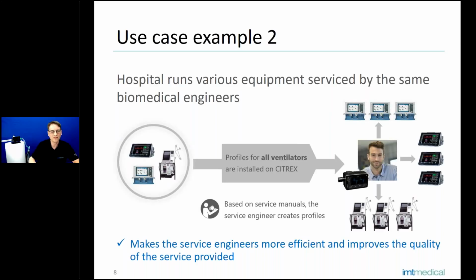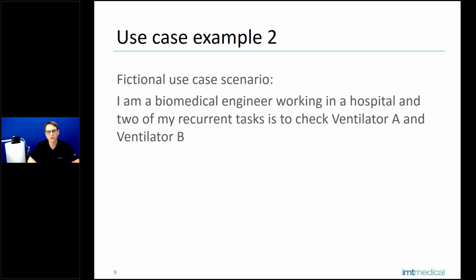So based on this use case example number 2, I want to show you now on my CITREX H5 here how you can create and load profiles. So I have a fictional use case scenario here.